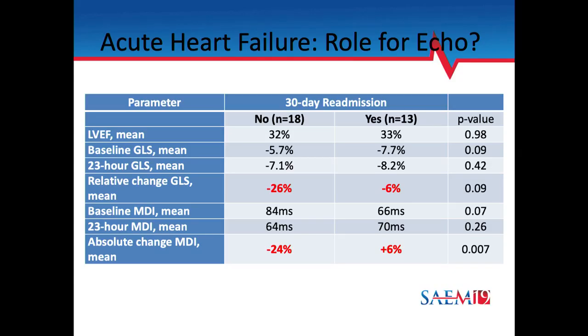This is data from a study that our group just published, led by Dr. Favot. So we had patients with acute heart failure who got an echo at time 0 when they arrived, and then 23 hours later, and we looked at 30-day readmission rates.